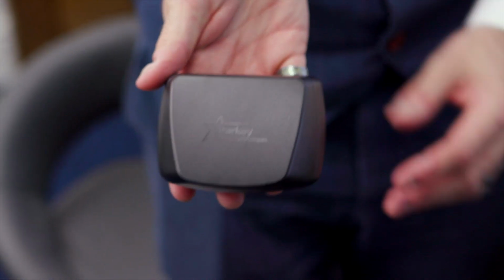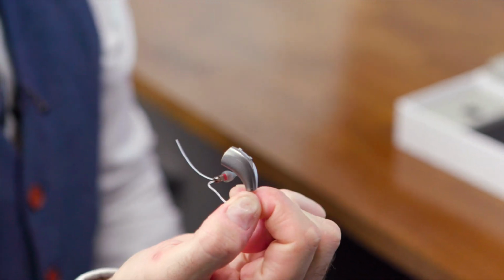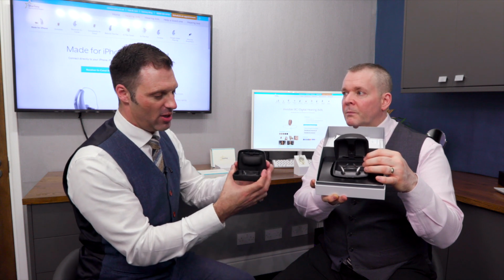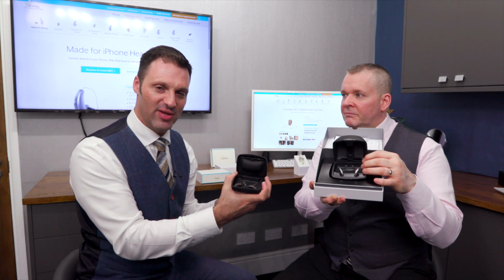This is changing quite soon. Again, I'll come on to that in a bit, but for now, you have to buy one or the other. Now, it's not a massive point for some people, but it is a little behind compared to some of the other manufacturers. Identical looking, but you have to choose one or the other. So, the design isn't bad. Now, some people don't like it. I quite like the design, but what I love is the reliability factor of these.